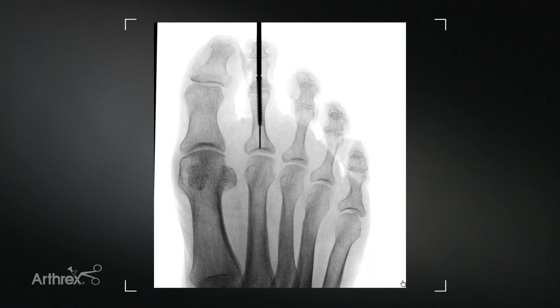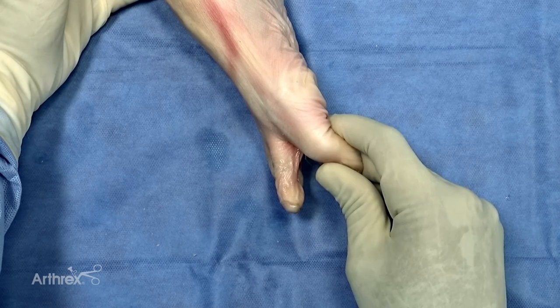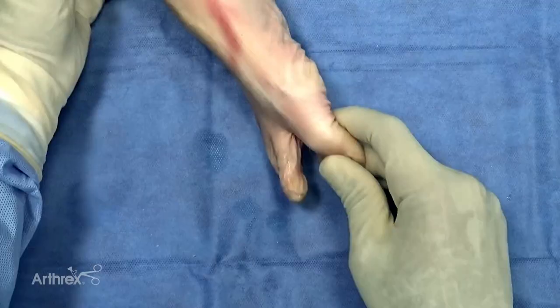I confirm on a lateral view, and I remove the wire. You can see our interspace incision is very cosmetic, and it's typically closed with a 4-0 monocryl stitch, and I close the distal incision as well with a 4-0 stitch.